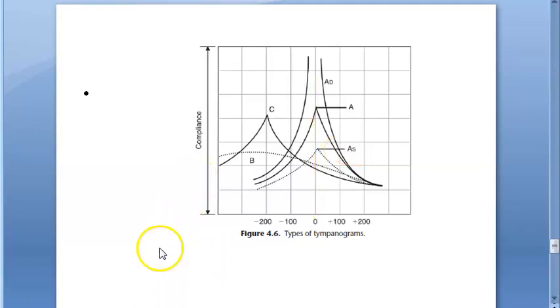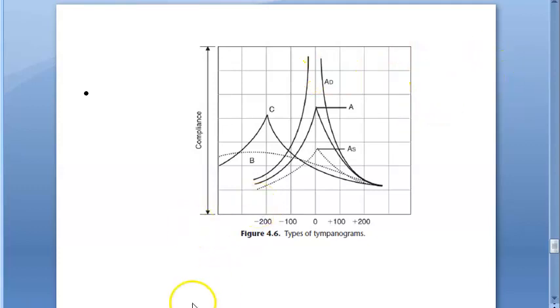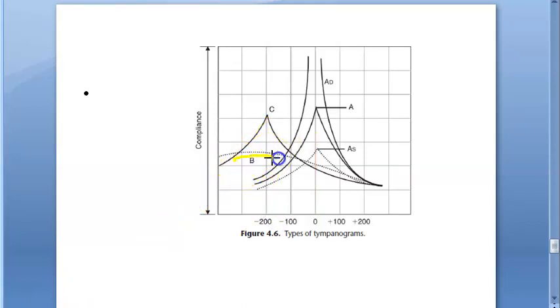Type Ad means higher compliance. You see Ad when there is ossicular discontinuity or a thin or lax tympanic membrane. These are all at ambient pressure. Now looking at Type B: it shows a flat or dome-shaped graph with no change in compliance with change in pressure. This occurs with middle ear fluid or a thick tympanic membrane.